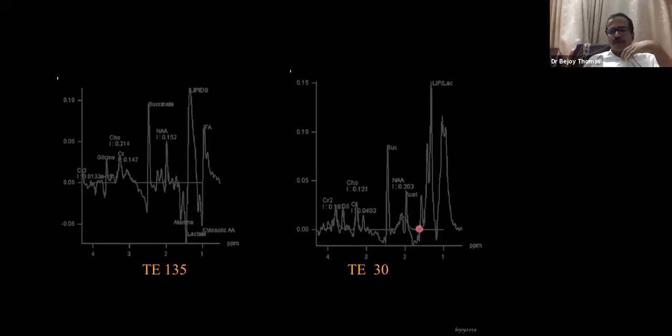But the moment you see acetate and succinate, that indicates anaerobic metabolism. We know that acetate and succinate are intermediary metabolites of the Krebs citric acid cycle, but in the steady state their concentration will not be there, because they are getting completely metabolized.